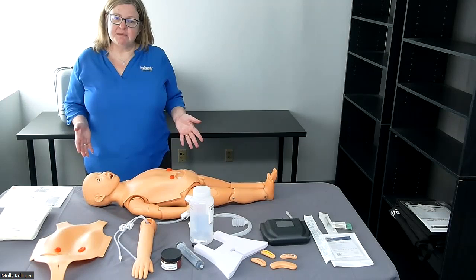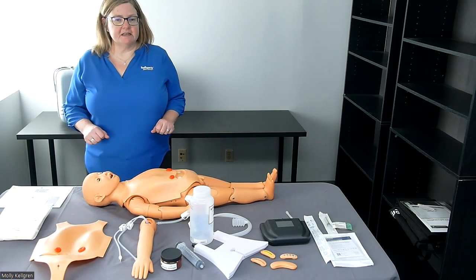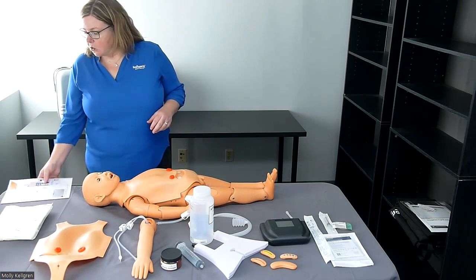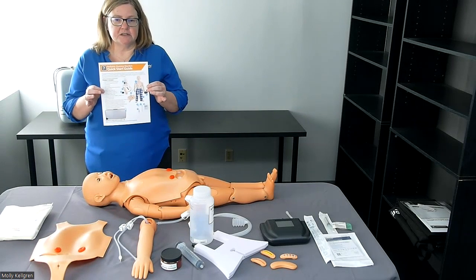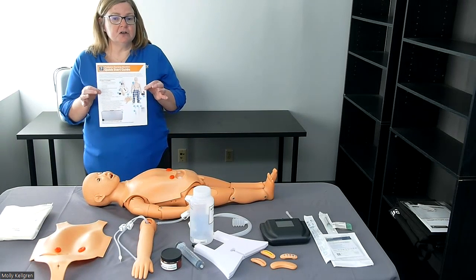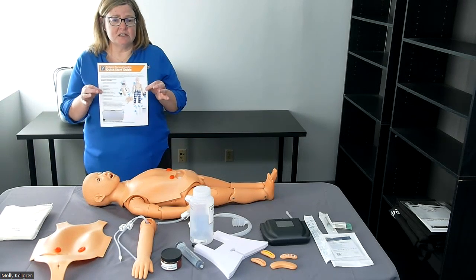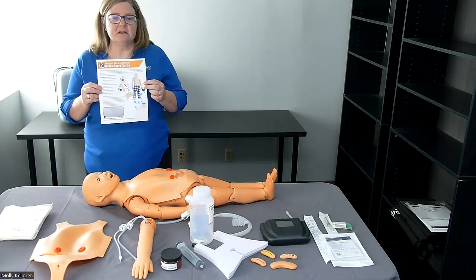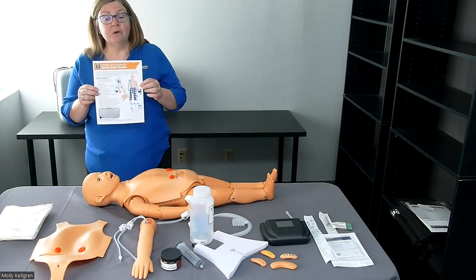Our pediatric nursing mannequin is the size of a three-year-old child, and there are many different skills that can be practiced using this mannequin. The product comes with a quick start guide — a great resource for the features and functionalities of the mannequin. It gives step-by-step instructions for using the mannequin, cleaning instructions, as well as a link to the included curriculum. Keep this in a safe place so you can refer back to it whenever you need.